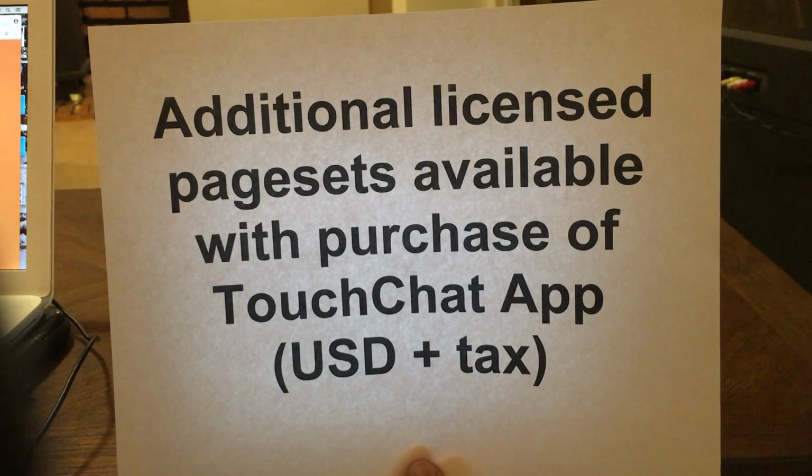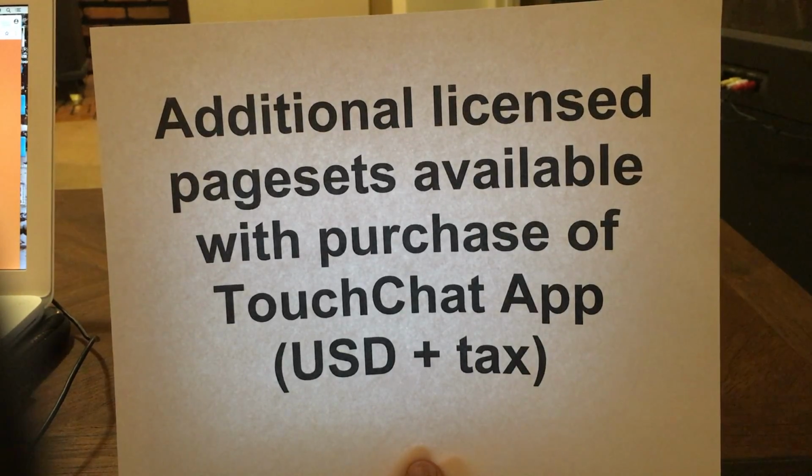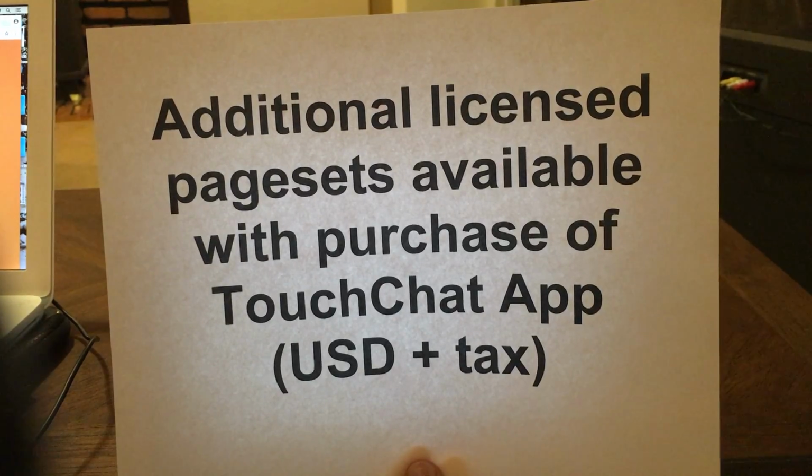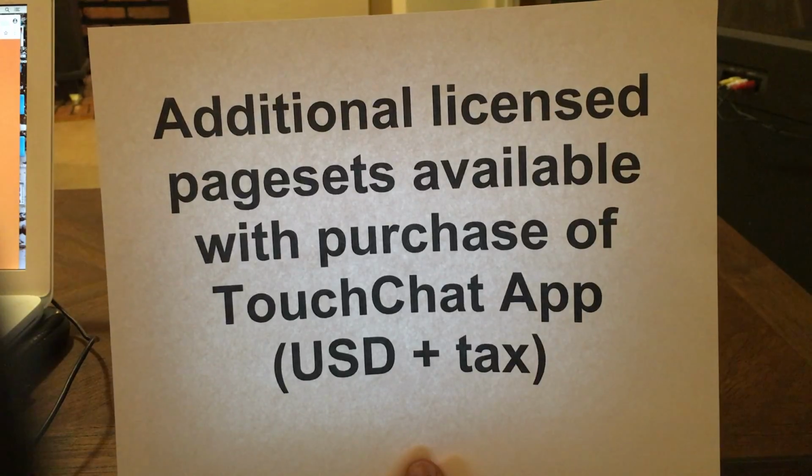Lastly, Pixon 6D for TouchChat can be purchased for $80. The options available are 10 manual communication boards, a curriculum, and various educational supports for children and adults to develop their language skills in order to become independent communicators.